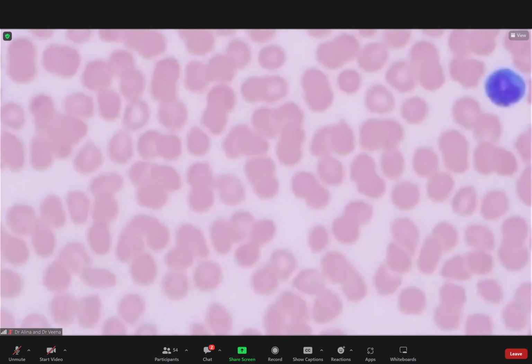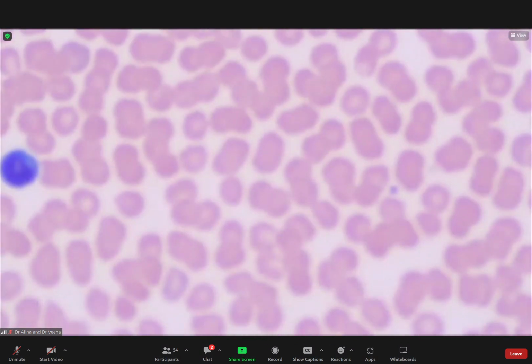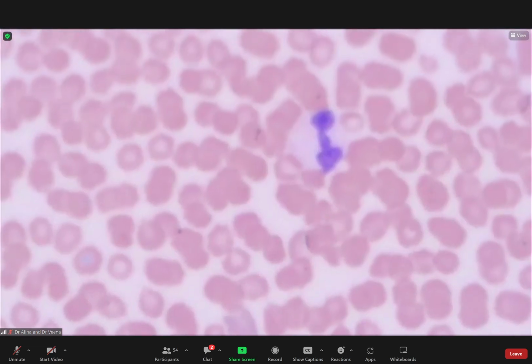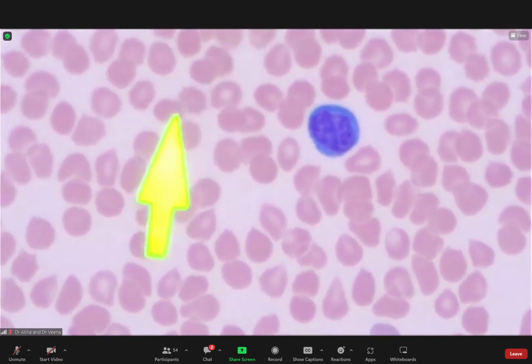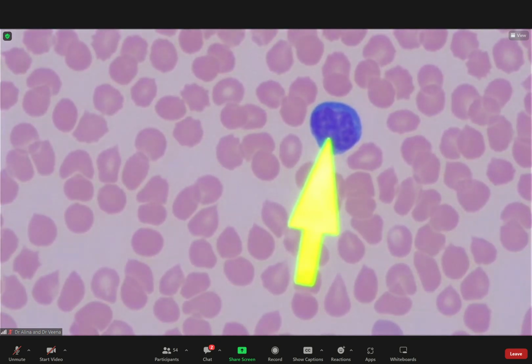Okay, I can see on your face that you are not convinced that these are plasma cells. I shall try to convince you. So, blue. There is a Golgi there. There's a perinuclear halo. Blue, very, very blue.